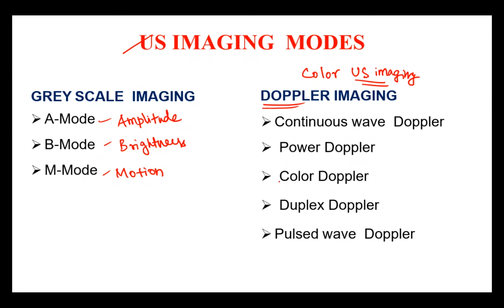So even India is manufacturing a lot of color Dopplers. The cost was high, but you can clearly see the color image of the babies, even babies inside the mother's womb.